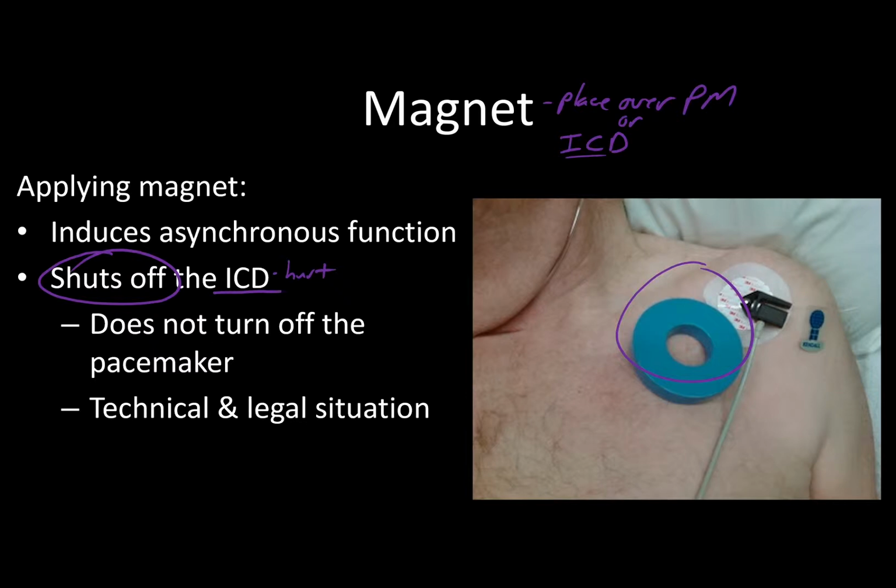If it's going off a whole bunch and it's not supposed to, you do that to help protect the patient. If it's going off because maybe it's an end-of-life case, that's a great reason to shut it off, because if it's end of life and they're on hospice or something, you don't want them to be shocked if it's unnecessary, because that's not the kind of treatment you want to provide. So those are two important scenarios I want you to keep in mind. But so that's for the ICD.